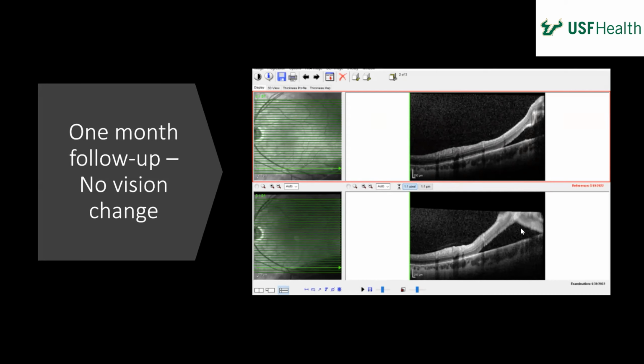Oh, I see. 50-50. Yeah, it is progressing, right? There you go. Yeah, this one's progressing. You know, it's nice. OCT is really nice. You could probably have figured this out with pictures, but with the OCT you get this 10 micron resolution and you can watch things a little bit. If you look on the back of the retina, you can kind of see the little serrated dots, the little photoreceptor things on that. But yeah, so this definitely progressed.